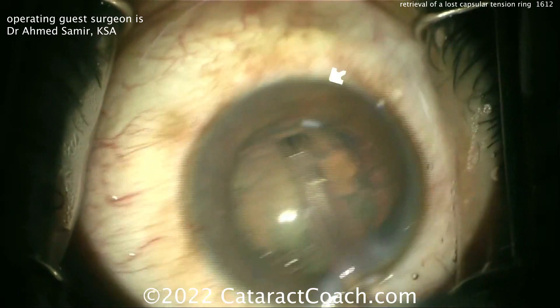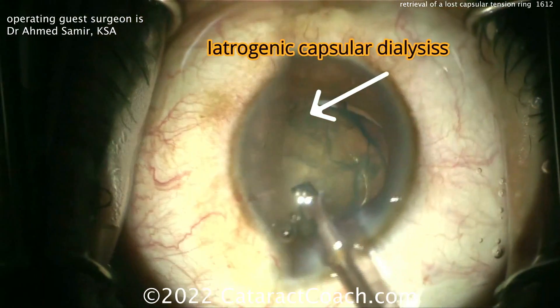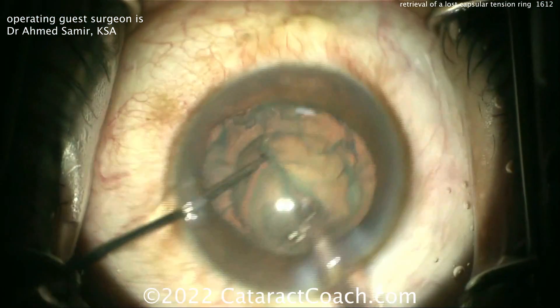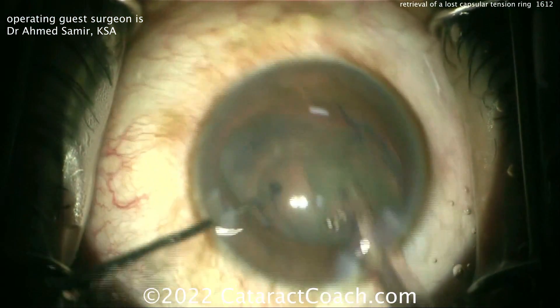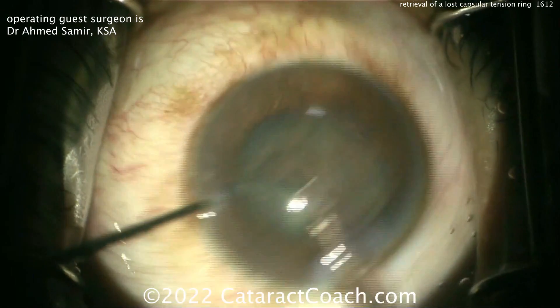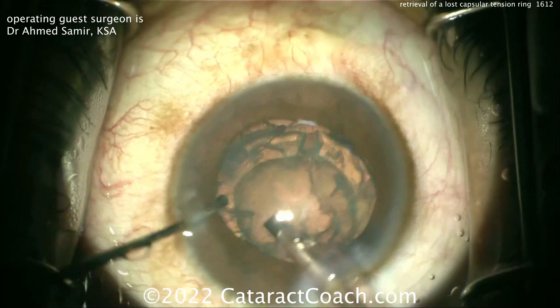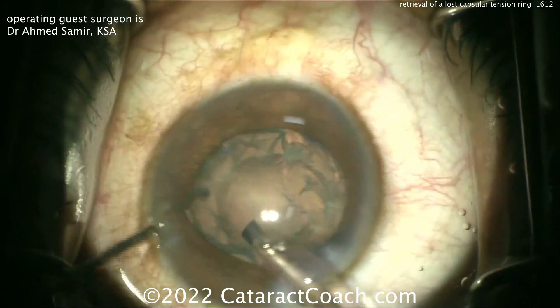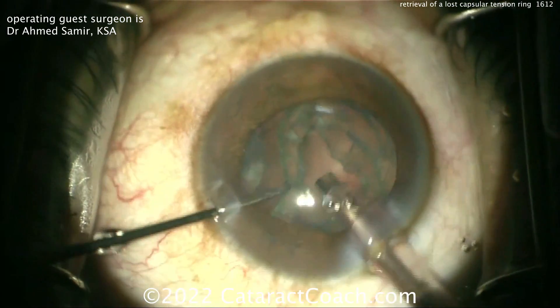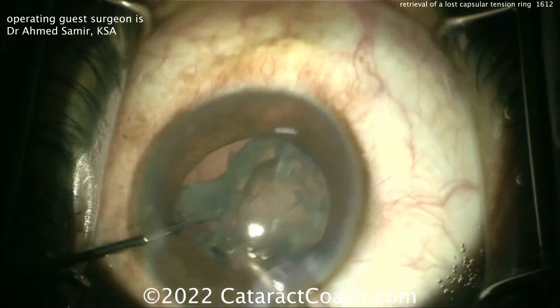Whoa — iatrogenic capsular dialysis. So we've got loss of zonular support for at least a few clock hours, if not more than that. And now it's going to be a very challenging case. The goal here is to get the cataract out of the capsular bag and then stabilize that capsular bag with a CTR — a capsular tension ring.